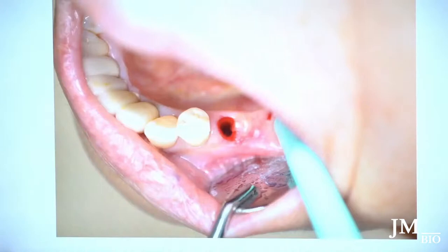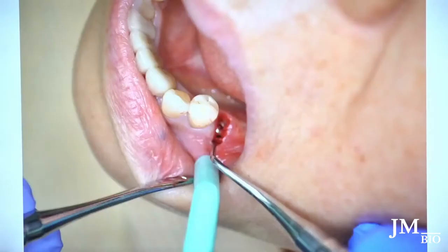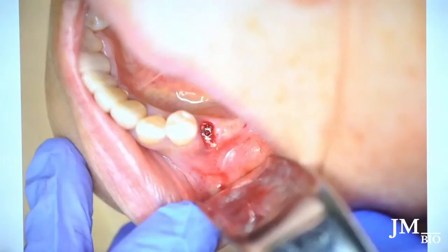This is a one-day implant I placed. I drive it down, the osteotomy is already created. There's a little bit of a jumping gap into the buccal, so I packed that with bone graft material. There's a cover screw on there right now but I'm going to change that to a healing abutment immediately, since I have good stability with the implant.